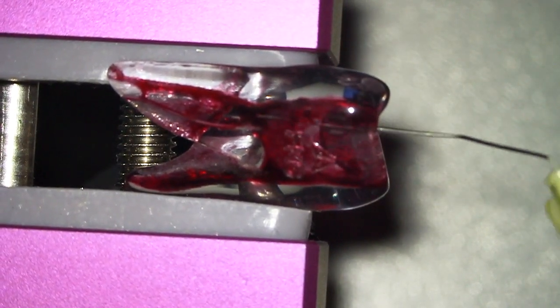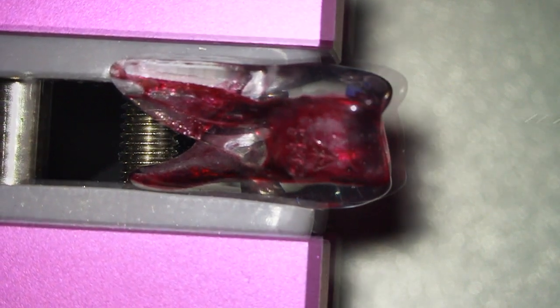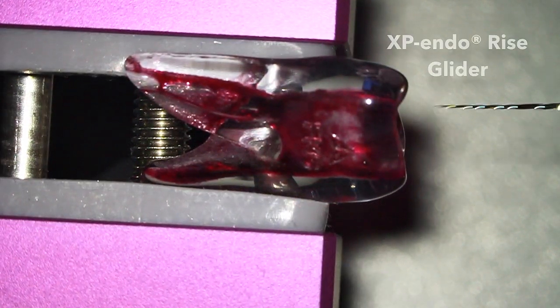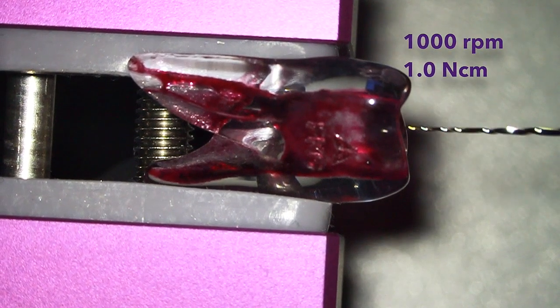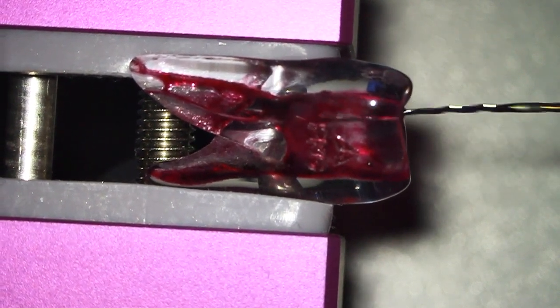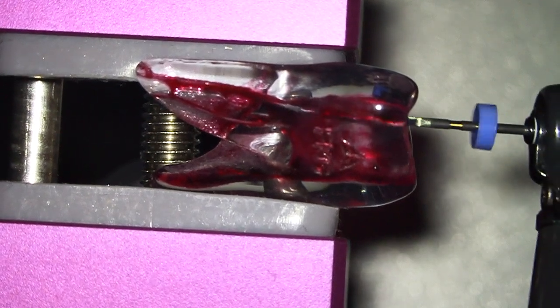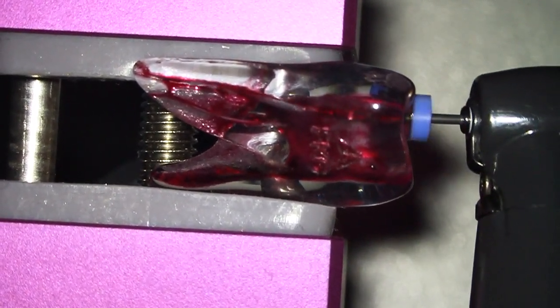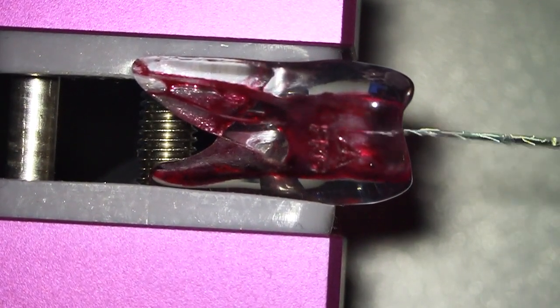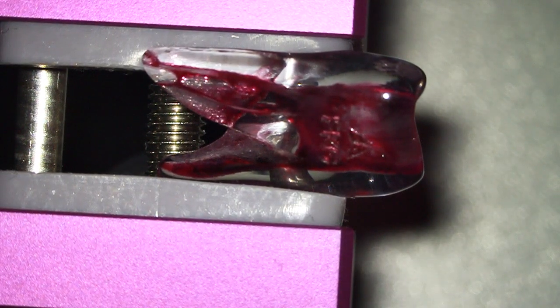Irrigation is an integral part of every non-surgical endodontic treatment. Having the initial glide path created, we can proceed to the XP Endo Rise glider to create more space. Remember to use gentle strokes of 2-3 mm and after 3-4 strokes remove the file from the canal. If the working length was not reached, clean the file and repeat.